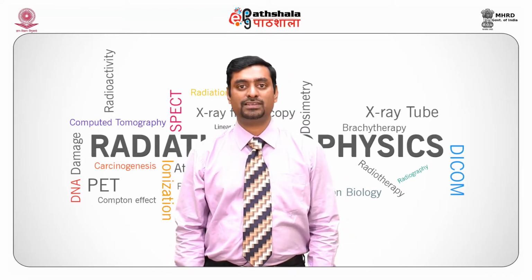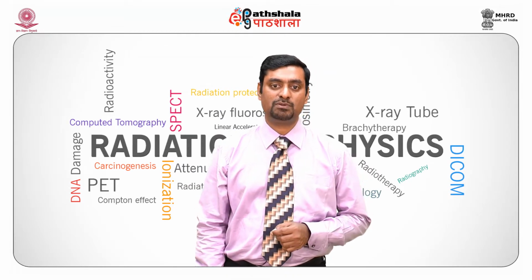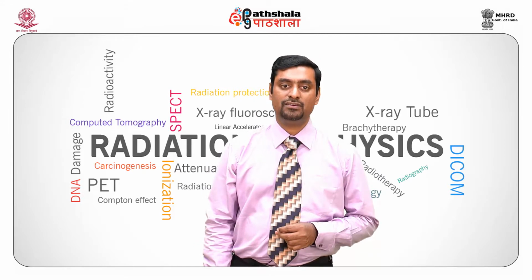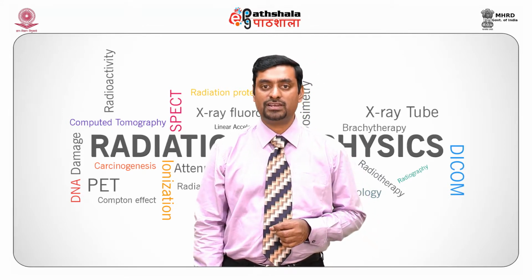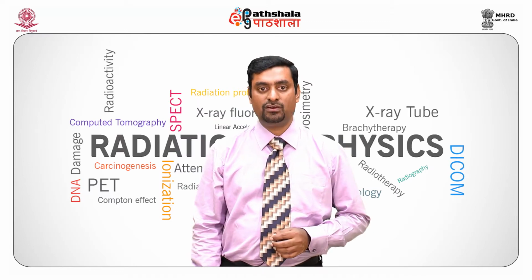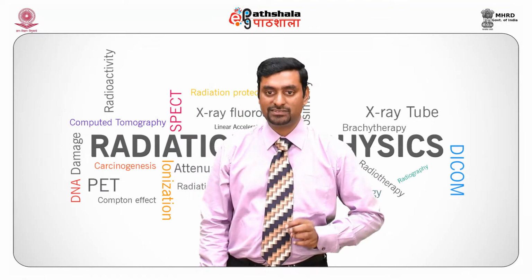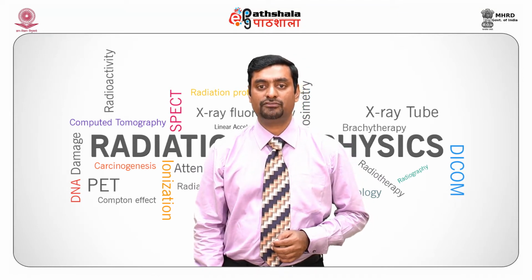Mammography also requires images of the highest quality to visualize low contrast visible mass and calcifications, which may be about 100 microns in size. Here we see an image where there are a lot of small dots which are visualized. There are about 5 pairs of dots in that image. However, some are not visualized. The best quality of mammography system would show up all the patterns that are seen in this phantom.